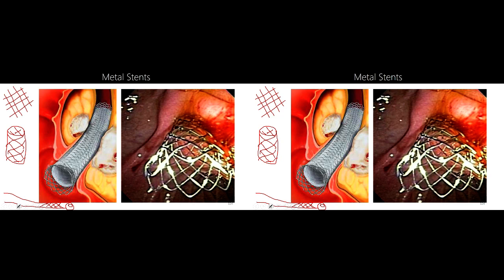The advantage of a metal stent like this rather than a plastic stent is that a metal stent will exert force externally, okay? The plastic stent stops crushing inward, but the metal stent will continue to push outward. It's going to try to get whatever tube it's deployed into up to its maximum normal diameter, okay?